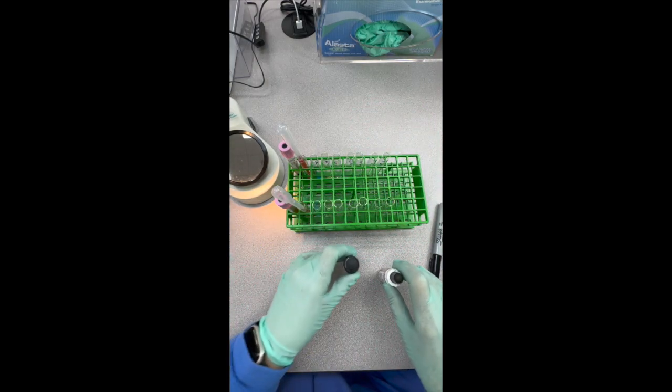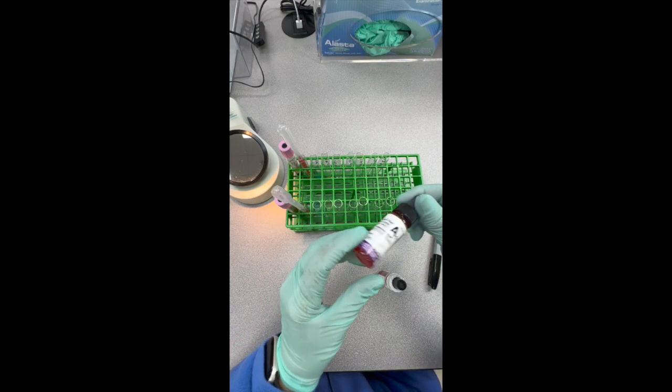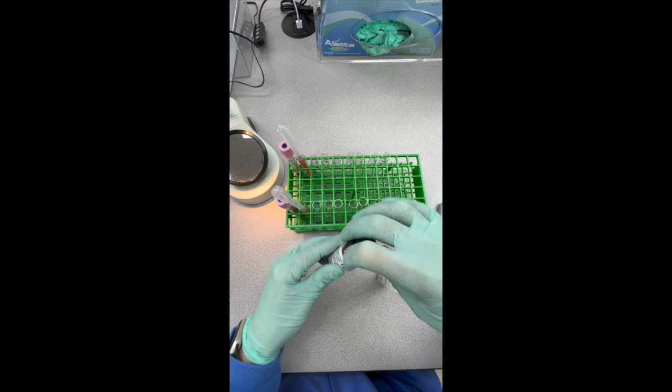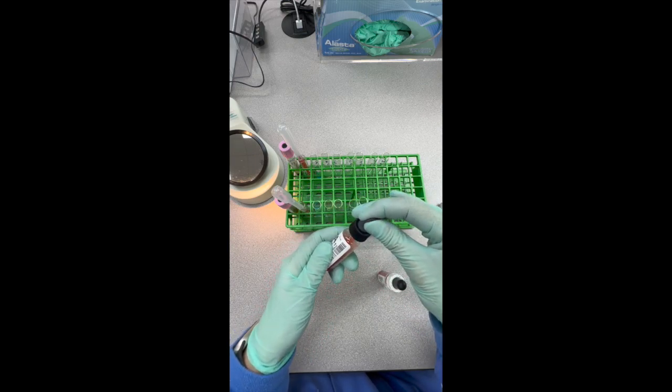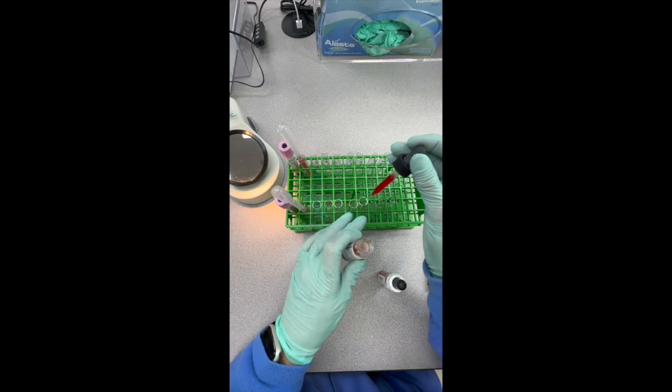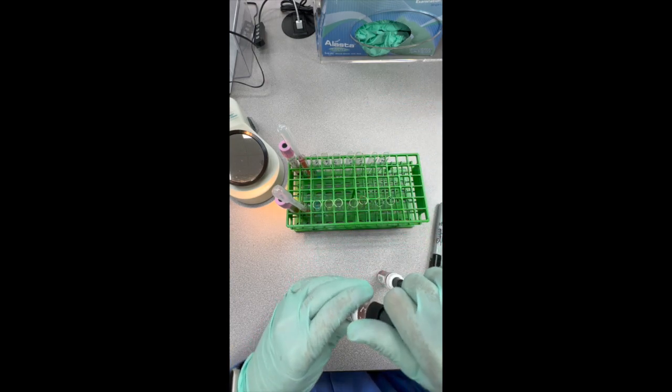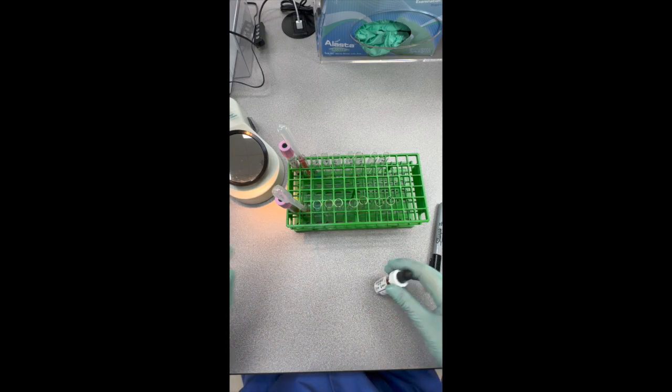Now onto our back type, we have our A1 cells. Remember, we really want to make sure these are mixed well since it's a cellular reagent. One drop into each of our corresponding tubes.